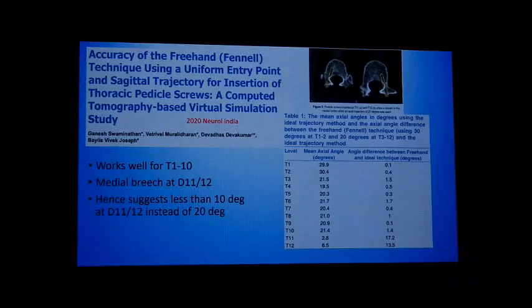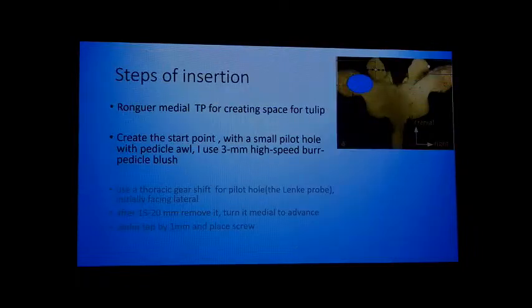So it is quite accurate. But at T11 and T12 we can see a medial breach. So they suggest that you should not use such a medial angulation. You can use less than 10 degrees angulation, or you can go slightly more lateral to put these screws.